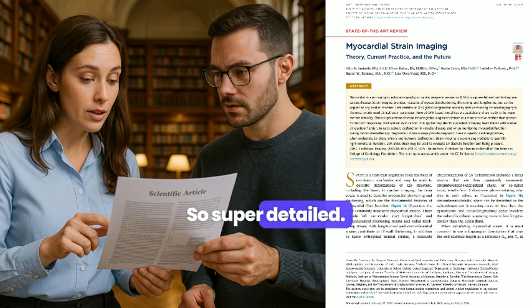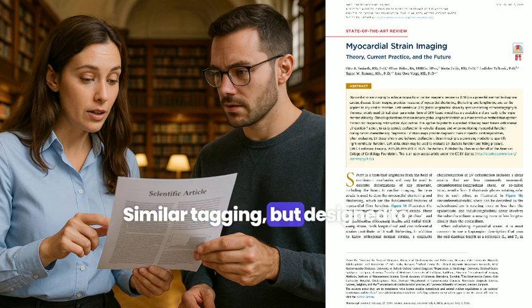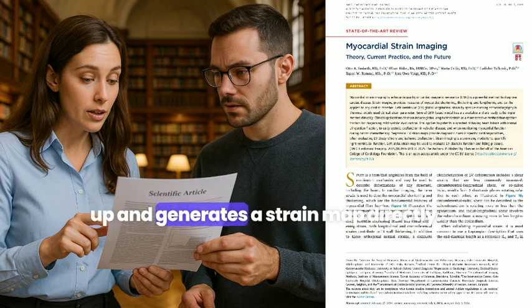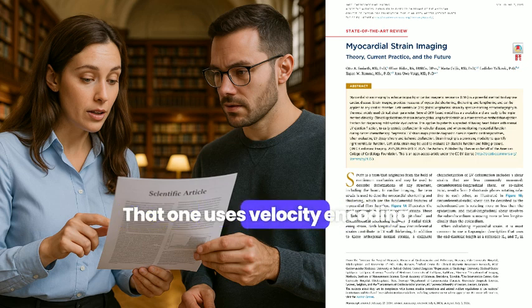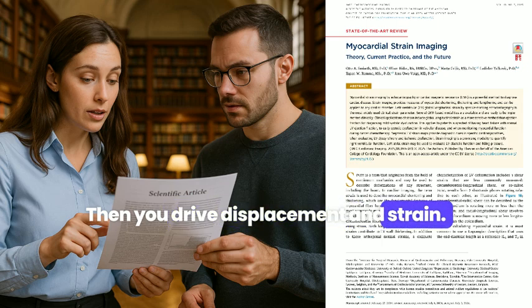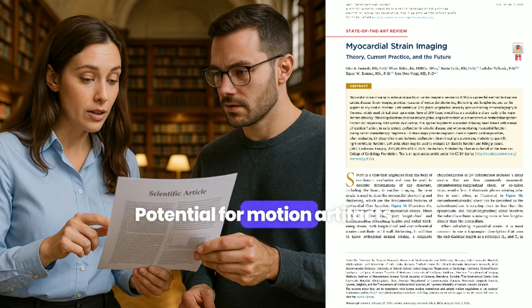So super detailed movement tracking. Very. Then there's strain-encoded imaging, similar tagging, but designed to capture strain through the image plane. It uses extra gradients to speed things up and generates a strain map directly. And tissue phase mapping. That one uses velocity encoding gradients to measure tissue speed, then you derive displacement and strain. But again, the longer imaging times can be an issue, potential for motion artifacts.